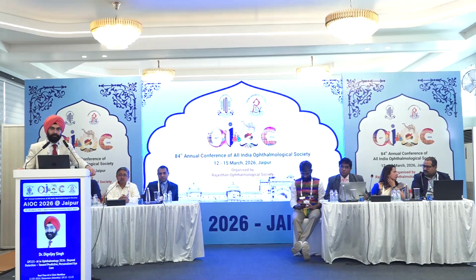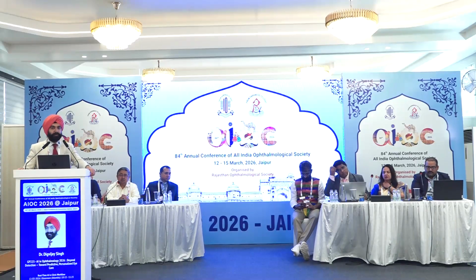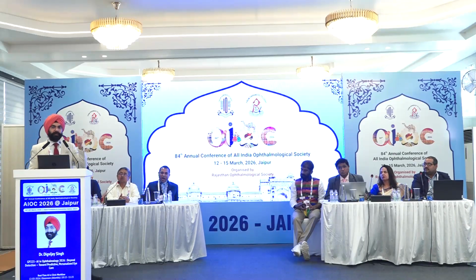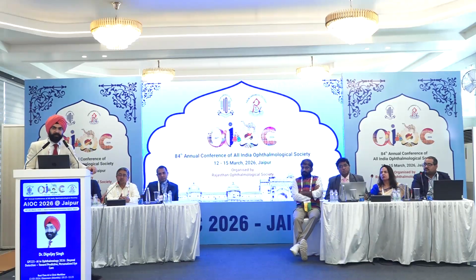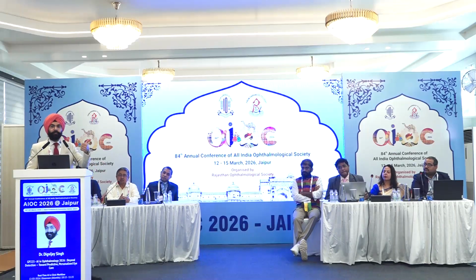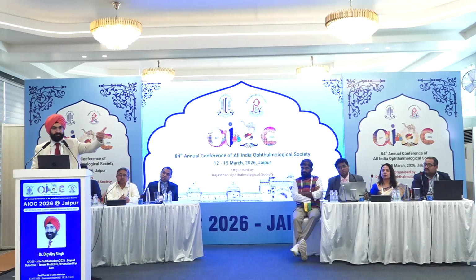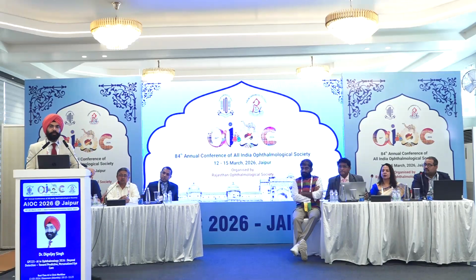So they are able to fairly accurately detect your OCT changes. The AI is so powerful that it is detecting each and every quadrant change. Absolutely, and it is detecting it faster than we would. There's also an interesting thing. I know that an OCT would progress typically for a person with aging at no more than about 1.35 microns per year in, let's say, the superior quadrant. If you tell it to check whether it is progressing more than it would by aging, it picks that up and tells you that if it was just pure aging, it would have changed from here to here over the last 5 years, but this has changed from here to here, so the odds of it progressing more are so and so.